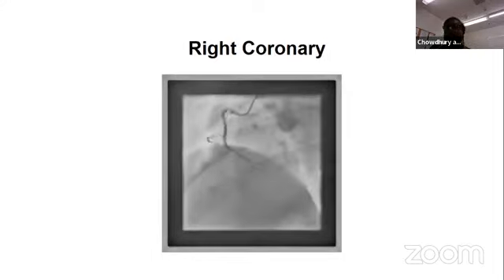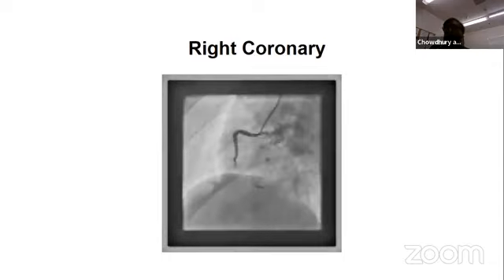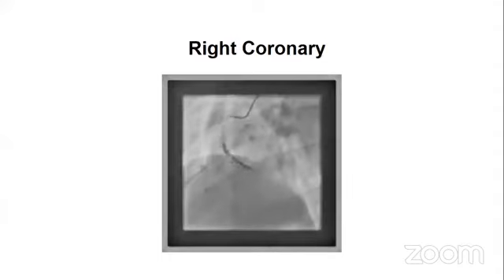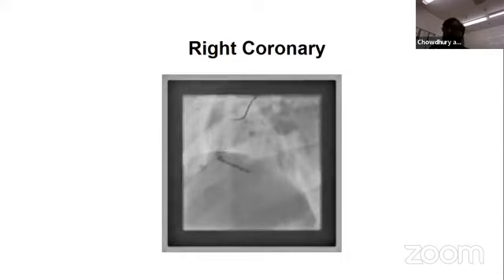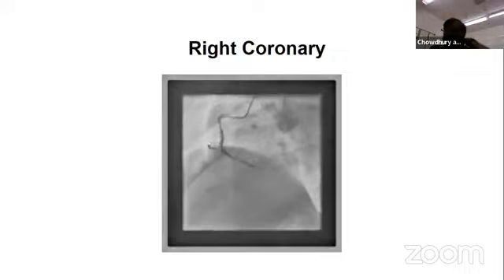But I would request this audience not to get bogged down with an obsessive compulsive disorder of finding out what the culprit artery is from the EKG. Yes. And I do have trouble accepting the sensitivity and specificity of Marriott's criteria, because that has been tested.